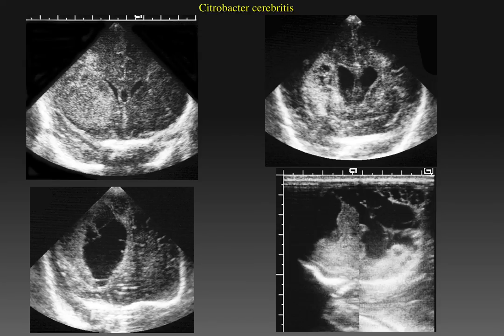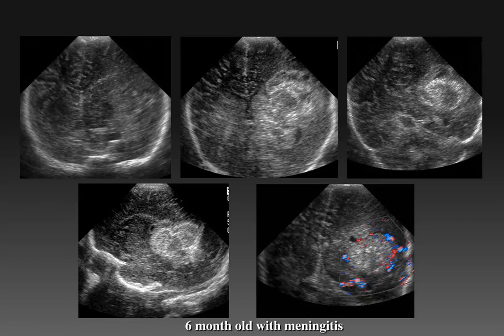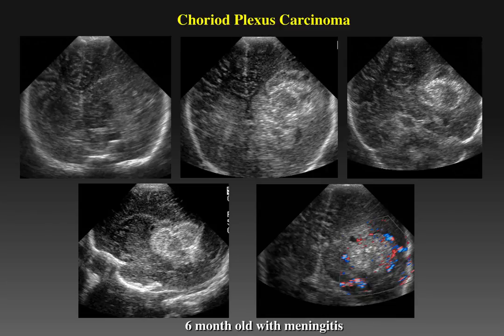It is very difficult to tell the difference between an abscess and liquefied ischemic brain in these infants. Finally, we have another child who presented at six months of age with the clinical diagnosis of meningitis. We see a very heterogeneous echogenic mass in the left hemisphere, initially thought to be a hemorrhage. However, on color Doppler sonography, this echogenic lesion has hyperemia and flow within the lesion, so it cannot be a clot. This child had a choroid plexus carcinoma.